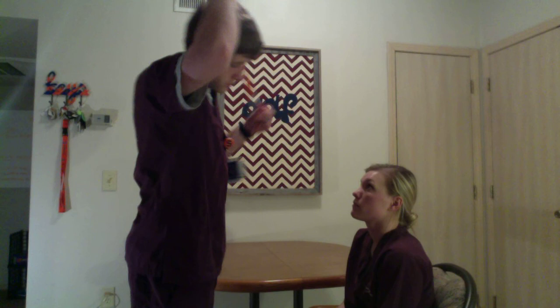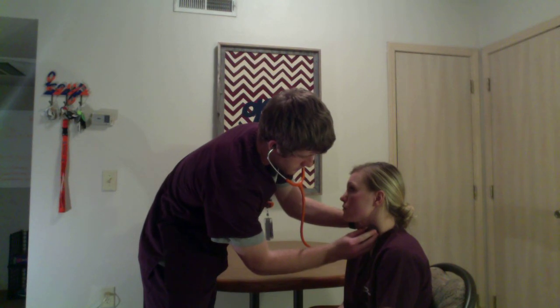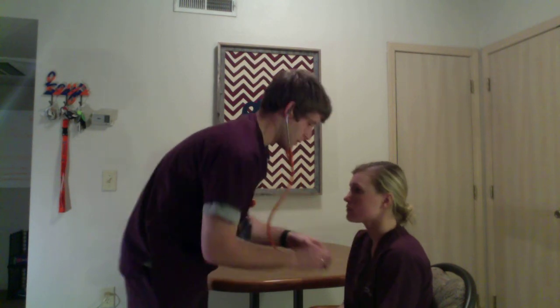Okay, now I'm going to auscultate. So I'm going to listen. And the other side.